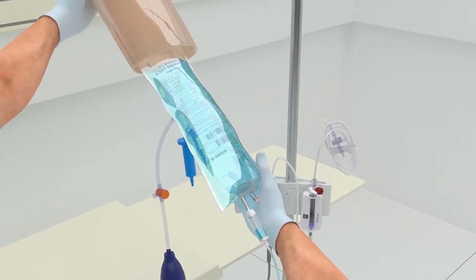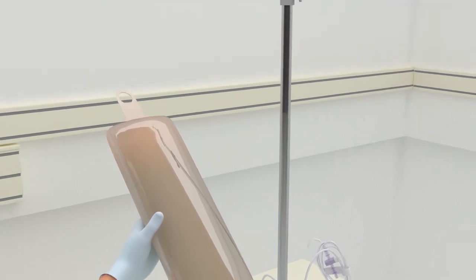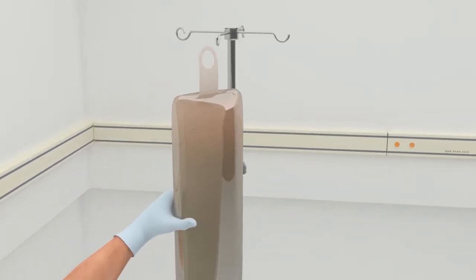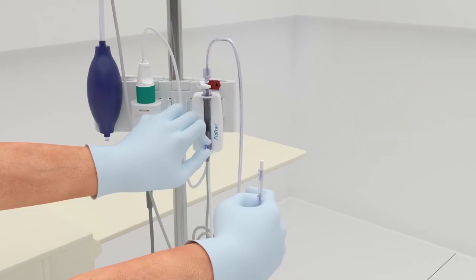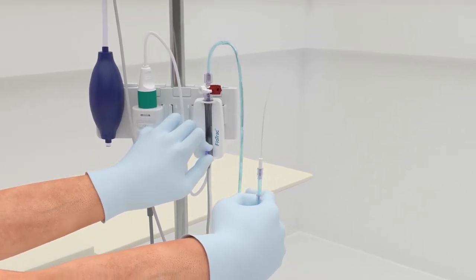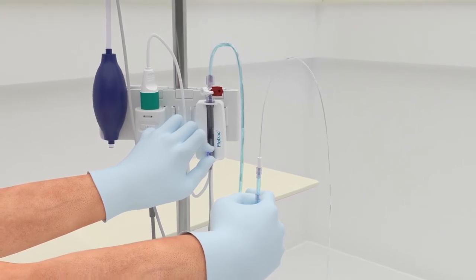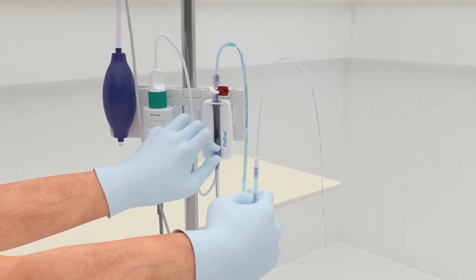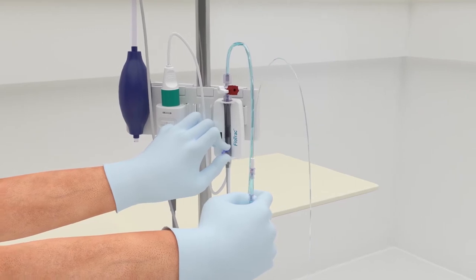Insert the fluid bag into the pressure bag and hang on the IV pole. Do not inflate. With gravity only, no pressure in the bag, flush the FlowTrack sensor, holding the pressure tubing in an upright position until the column of fluid reaches the end of the tubing.